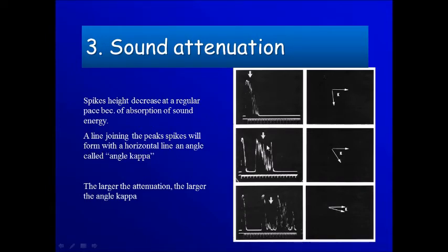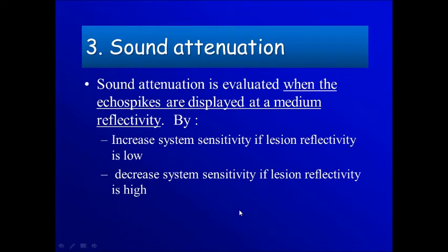So this represents marked attenuation, this less attenuation, and here small attenuation. Sound attenuation is evaluated when the echo spikes are displayed at medium reflectivity, either by increasing system sensitivity if the lesion reflectivity is low, or by decreasing system sensitivity if the lesion reflectivity is high.